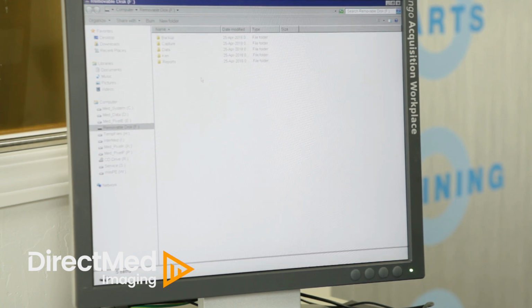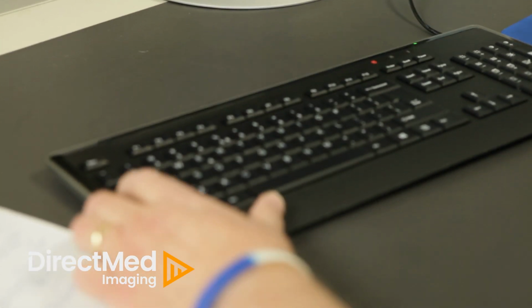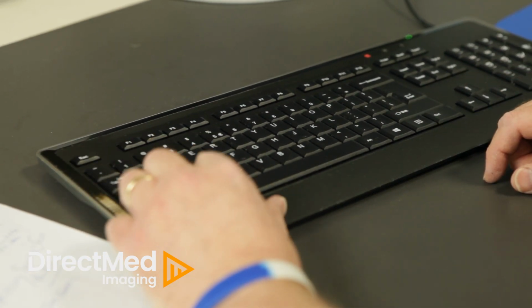If I want to save a backup to an external device, this is by far the quickest and easiest way to do this. Again, we can toggle the Windows key off when we're done with our service project or our backup and maintenance, and the techs will have no idea what we were doing.